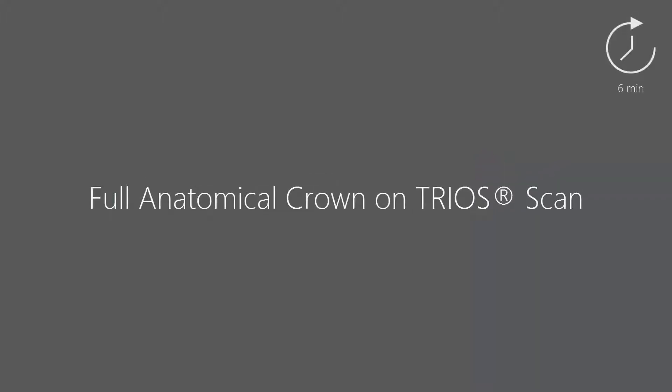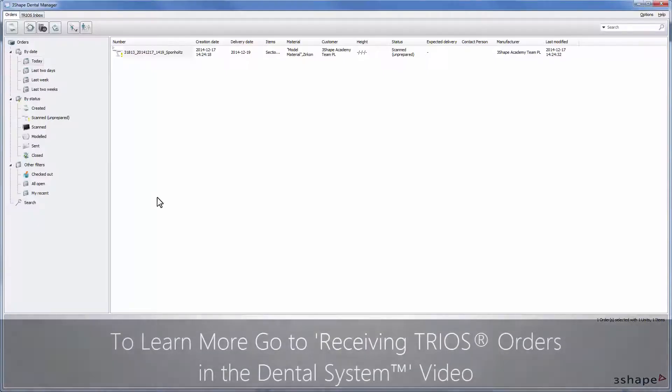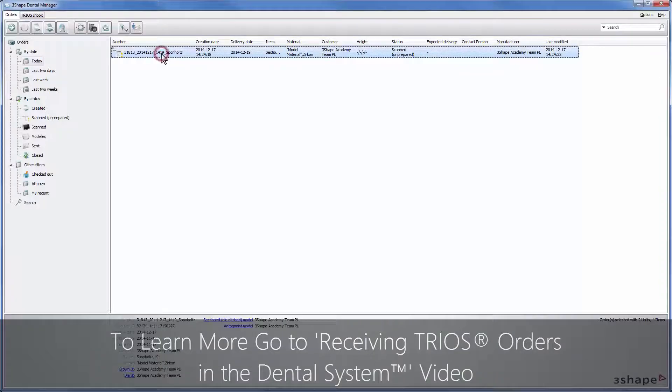In this video we will show you how to design a full anatomical crown on a TRIOS scan. To start your design, you need to open your unprepared TRIOS case from Dental Manager.